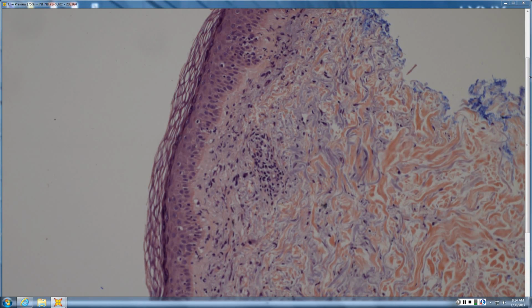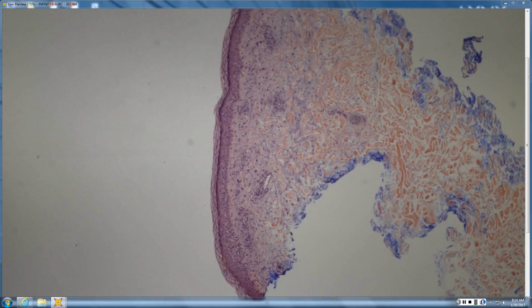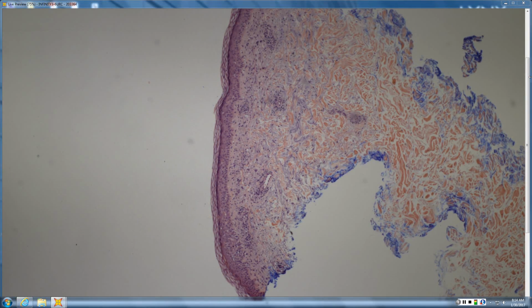So does this one have long, slender rete? No. Does it particularly have endothelial swelling, or do you see lumen? I see lumen. A little bit of a busy dermis. That's about it. And then you've got interface. And so a lot of the things that we depend on, plasma cells, neutrophils in the horn, are not there. Does that mean this patient should get TABs because it's their own fault? They should have had more histologic features if they wanted their syphilis treated.